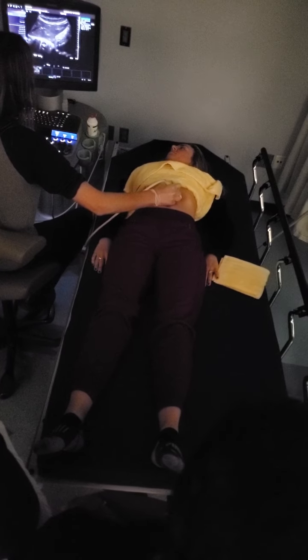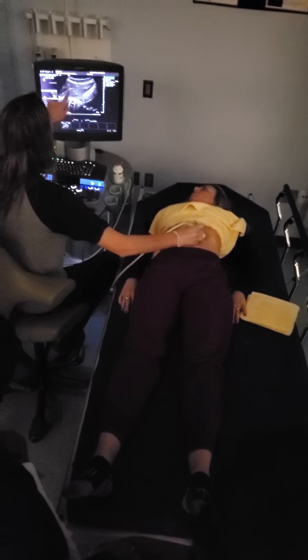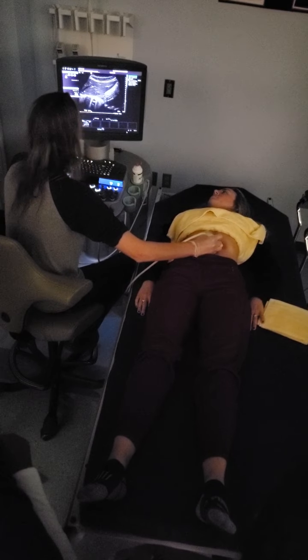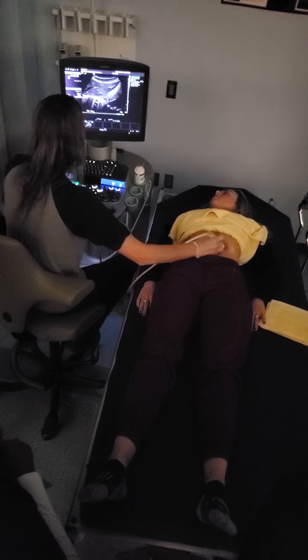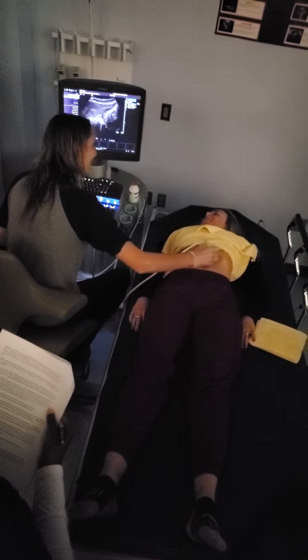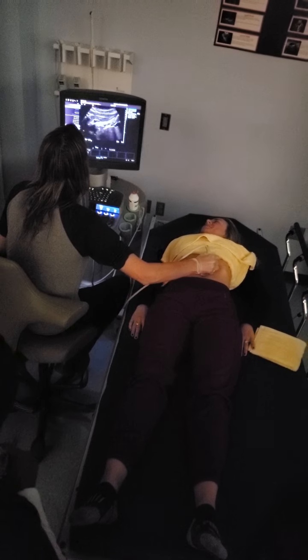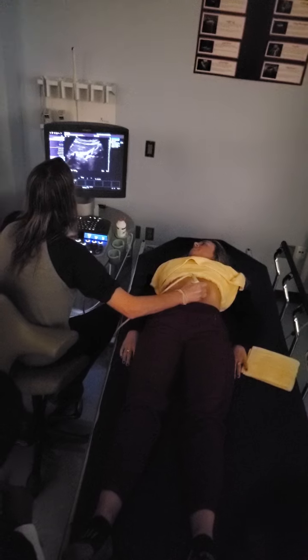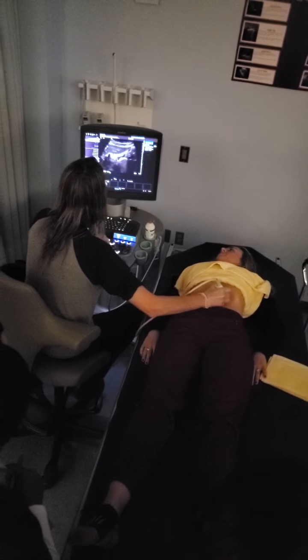We're going to end up in vessel land here. We've got a little bit of a hepatic, just kind of showing those features. We may see a portal. Whatever you want to show me is fine, but we're just showing those features. And big breath in again. And then as we get all the way down to kind of this pancreas land, we'll go up a little bit more, so you're showing me a little bit more meat and potatoes, but I'm going to get rid of some depth.